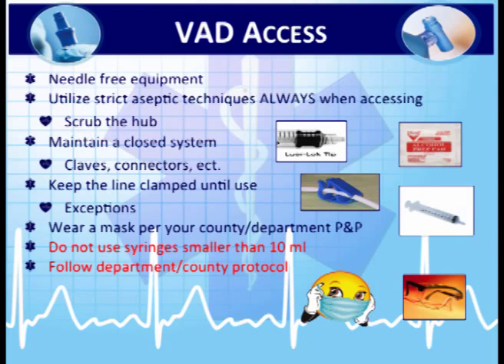A couple things about vascular access devices before we take a stretch and before you guys start doing your hands-on practice. Needle-free equipment. Pretty much everything is Luer lock. It's very safe for us and patients, and that's what we should be using for the access. Med ports, obviously they need a needle to access, so that's a little bit different. But for our connections, when we're pushing medications, needle-free equipment.